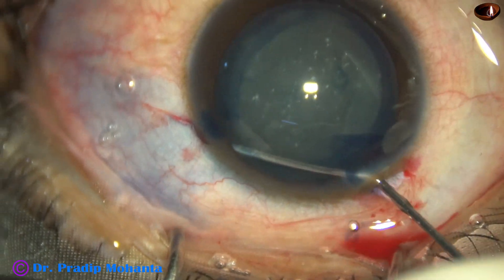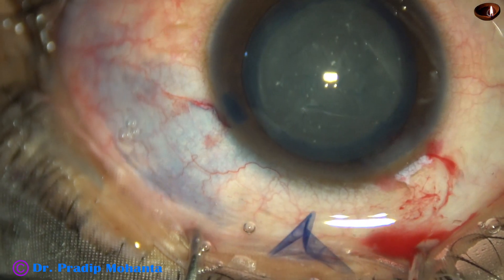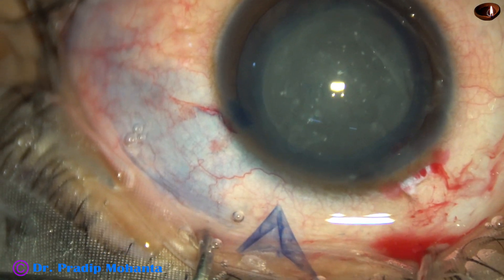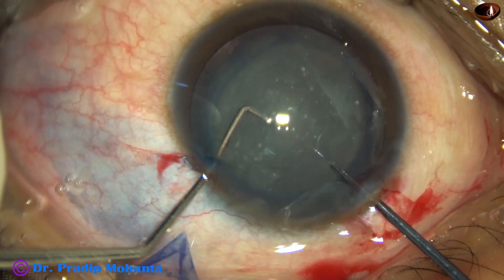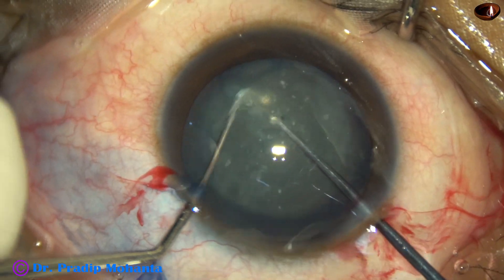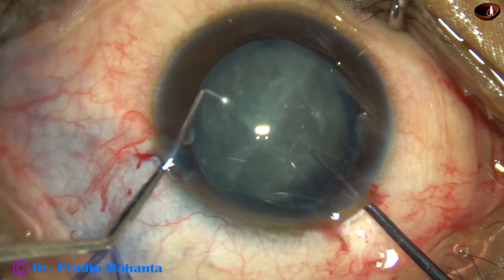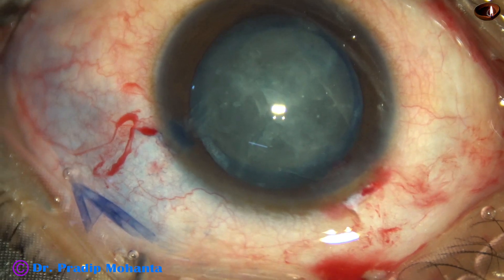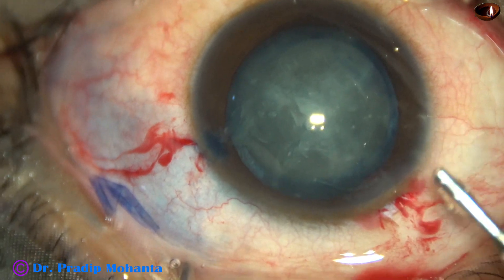And now hydrodissection is done. I used Dr. Sohail Khan's pre-chopper in this case to facilitate management of the nucleus. However, I could not separate the nucleus nicely, but whatever separation was done helped to some extent in the management of the nucleus.